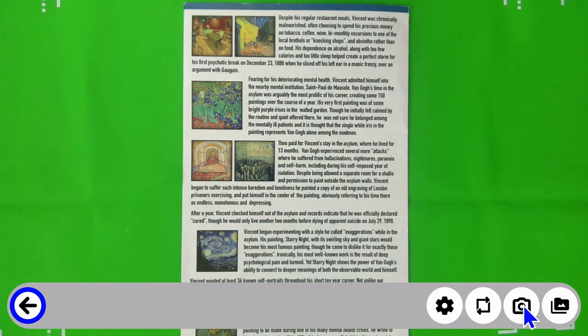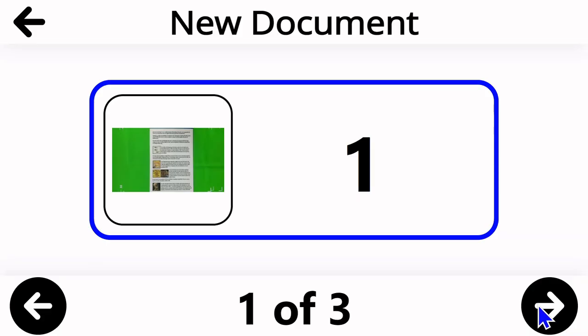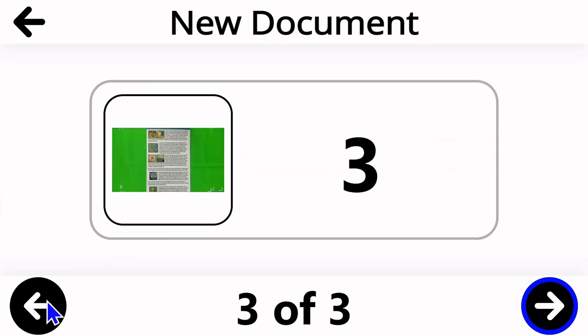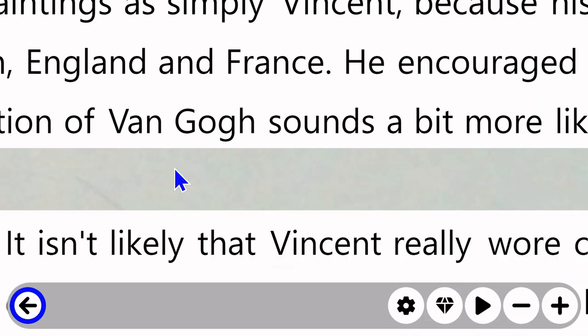We're just rapidly capturing pages. So this can be useful if you know that you're going to have a multiple page document that you need to read and navigate. You'll capture it all at once, get it saved, and then you'll be able to go back and read it. So let's go to the right here, click, and it will save and take me directly to that document in my Files application now. And I can click and see that I've captured each of the pages in there. And I can open each of them individually by clicking on them.